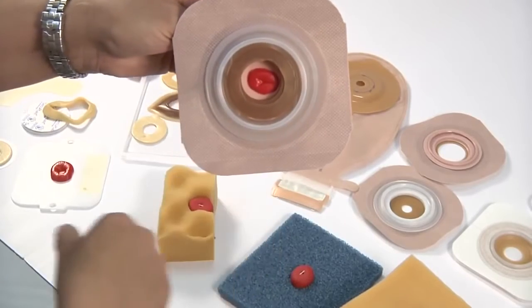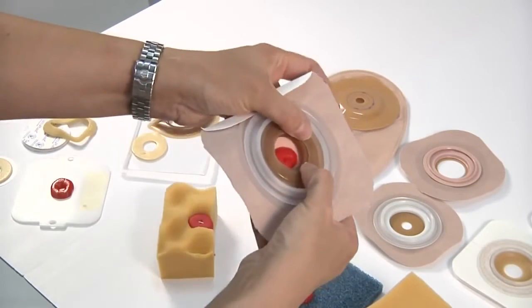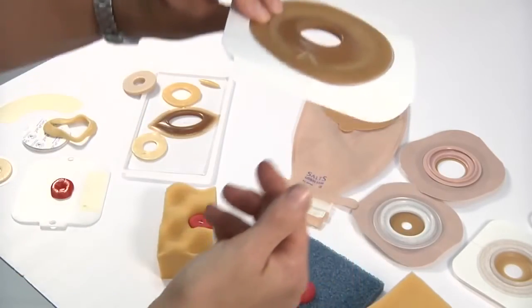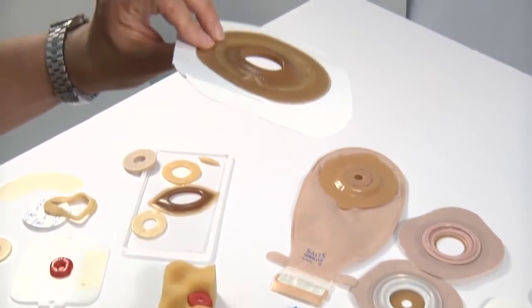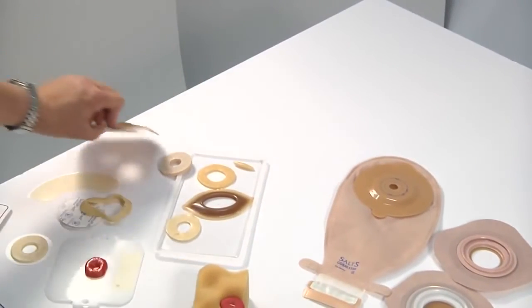Obviously, too much of a gap, you'd want to make it a little bit smaller there, but you can start to see that you're actually filling in around those creases and gullies a little bit better. Okay, so again, fairly low level, and using a flat plane and actually taking two pieces and putting it together.